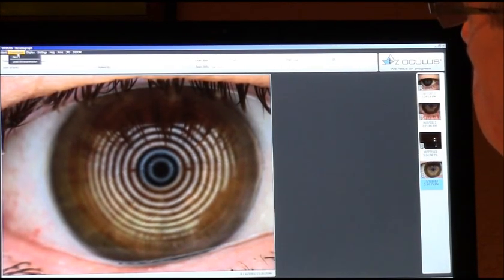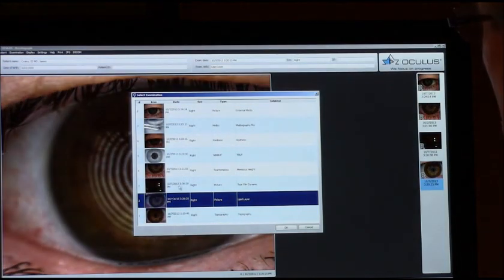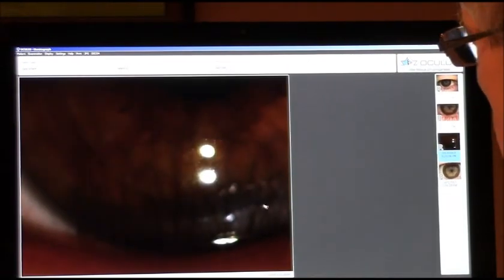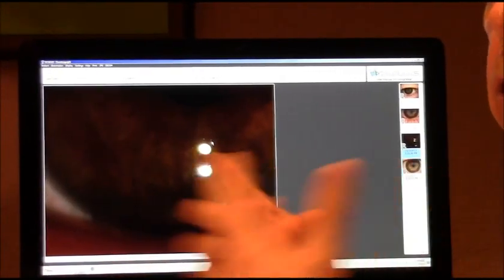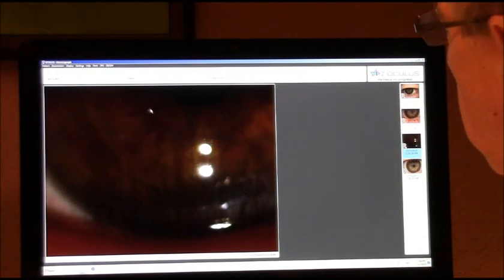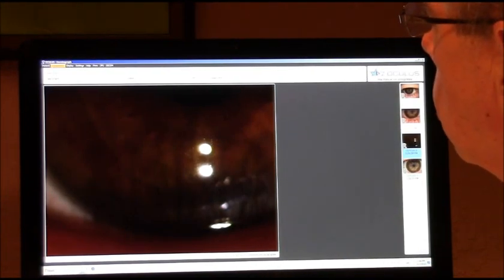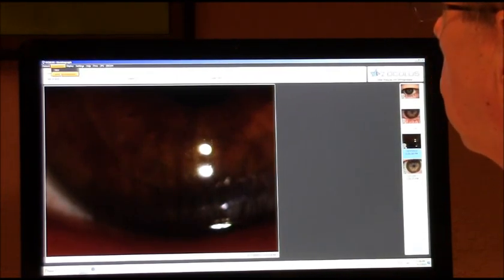The next test is actually a movie. It may not show very well here, but it takes a video and you can watch the tear film move around on the surface of the eye as the person blinks. If your tear film is very thick because there's not enough liquid layer, the motion is very limited. Whereas if you have lots of tears, the motion is a lot. This is another parameter we use to evaluate your dry eyes.